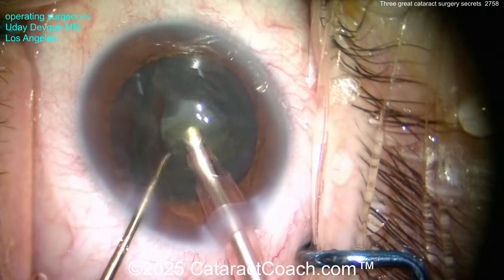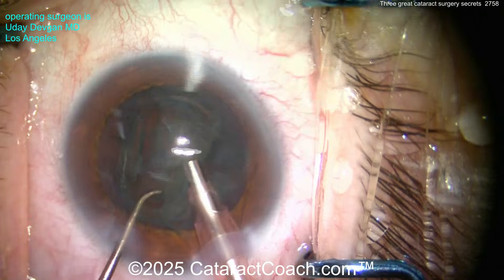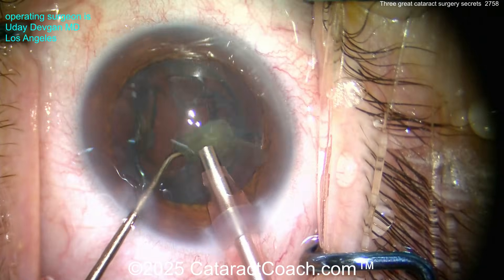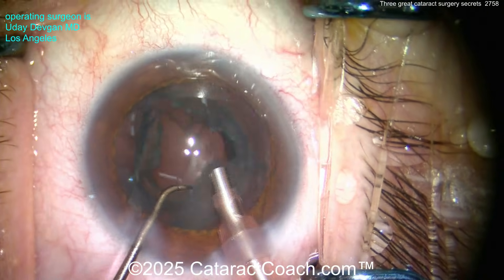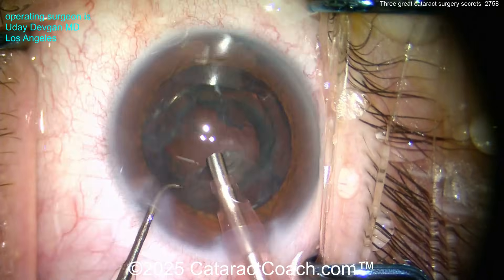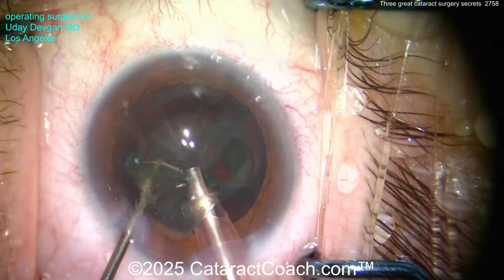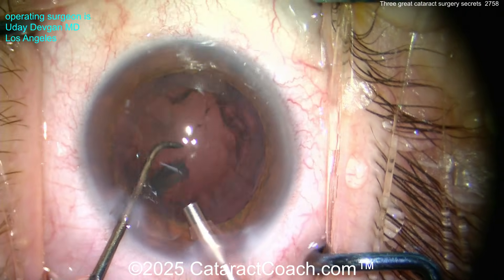The third pearl: when you have a big thick epinuclear plate — an epinuclear shell — you want to flip it over. There's the last piece of the cataract nucleus out, and now you've got an epinuclear shell remaining. Grab the edge with vacuum only — no energy, vacuum only. As soon as you grab it, use the chopper to help you. Pull with the epinucleus upside down — and there it is, it comes out so easily.